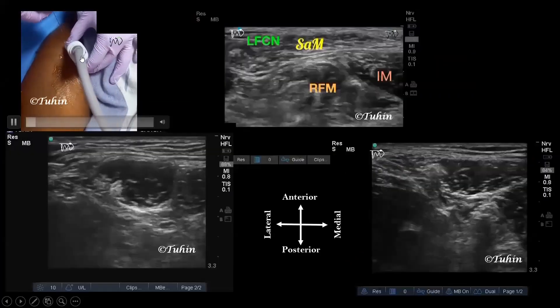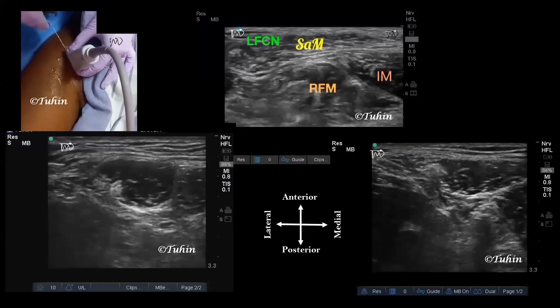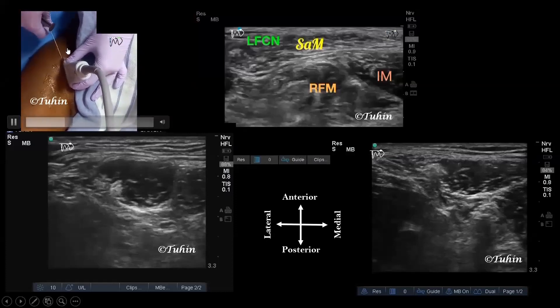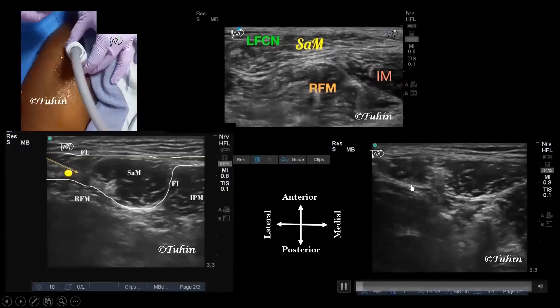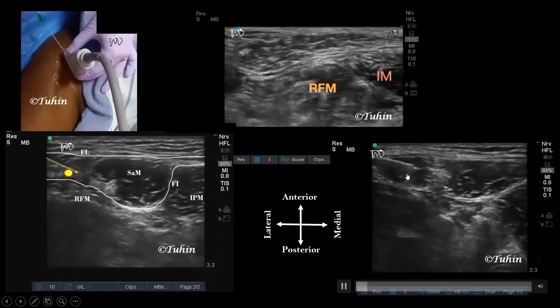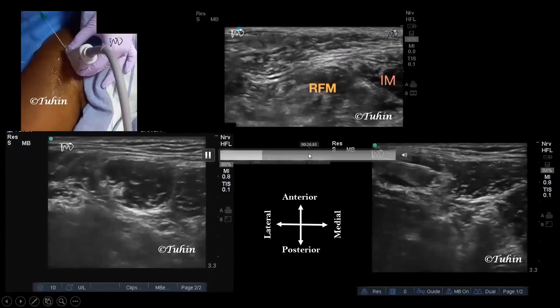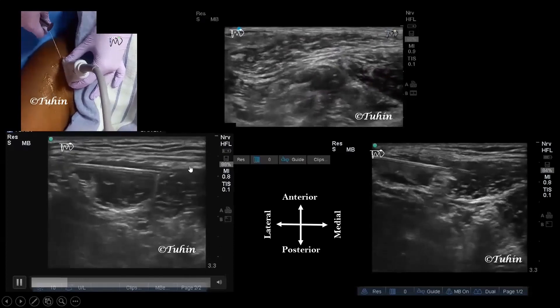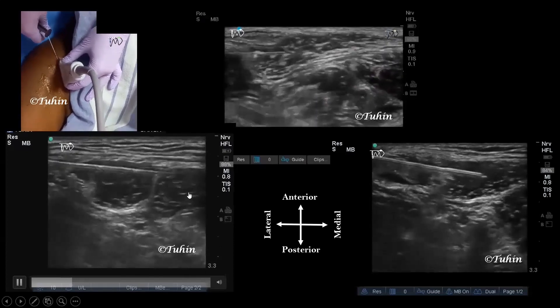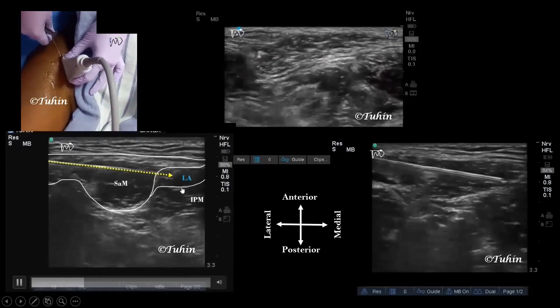The ultrasound probe is placed just below the inguinal ligament, medial to the anterior superior iliac spine. The needle entry point is from lateral to medial using an in-plane technique near the anterior superior iliac spine. After piercing the fascia lata, 5 to 10 mls of local anesthetic is deposited to block the LFCN. The needle is then advanced medially to place the tip between the fascia iliaca and the epimysium of the iliopsoas muscle, where 15 to 20 mls of local anesthetic is deposited.